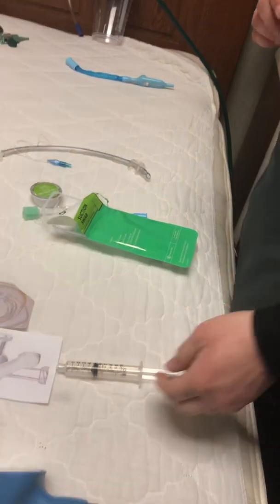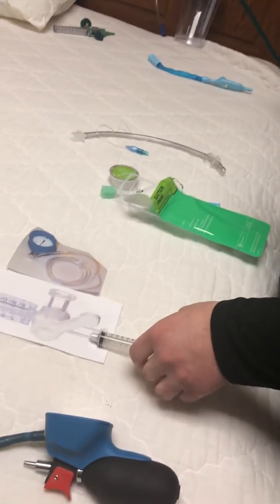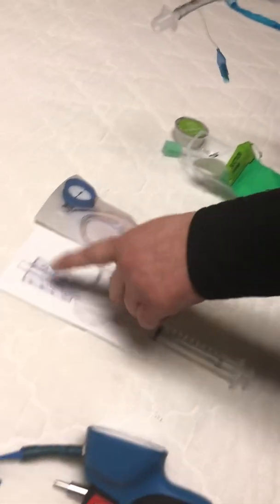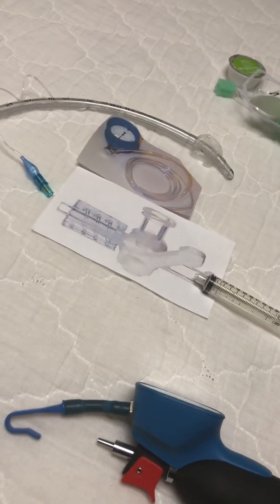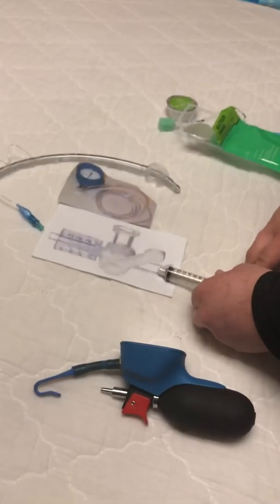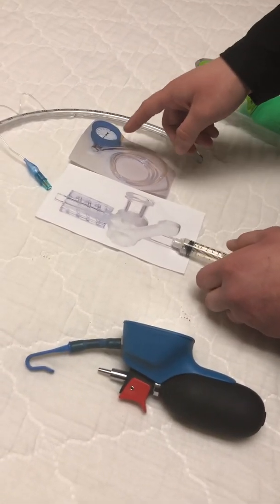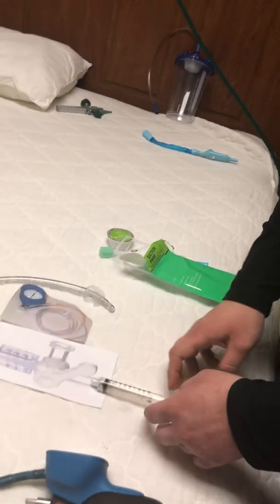So when you're ready, you're going to get your piece ready. So you're going to do your minimal leak technique here. You're going to connect your syringe to one side, and then you're going to have a meter with the tubing, and you're going to connect it there. And then you're going to connect your other end to your cuff. And when you're ready, what you're going to do is always listen to the side of the throat. So you're going to listen right here with your stethoscope, so that you can hear that first initiation of that first leak. You're going to take your syringe and slowly remove air. And you're also going to listen, and once you start hearing that first initiation of that leaking sound, you're going to look at your meter and chart down where it was when you first heard that leak.